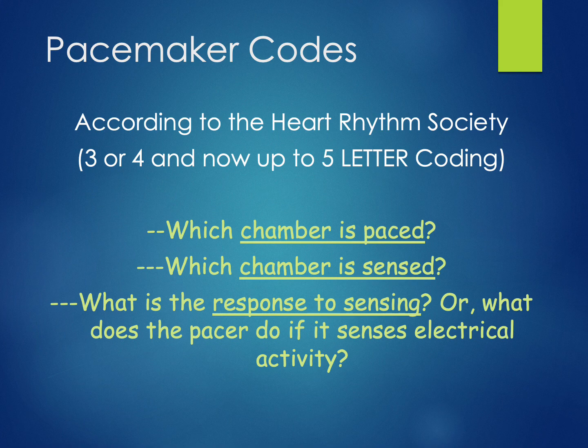So this is a lot of detail that I really don't want you to worry too much about, but just be aware that you may see modes that say VVIRO, and that just is telling the cardiologist and telling the CVICU nurse what is going on in each chamber of the heart and what the settings of the pacemaker are. This is not something I will test you on. I just want you to be aware that when you hear these letters being put together, that is just the pacemaker code, telling us a little bit more about what that pacemaker is doing.